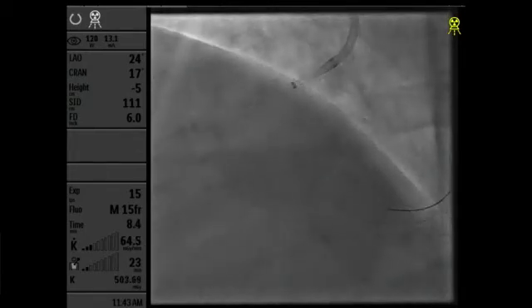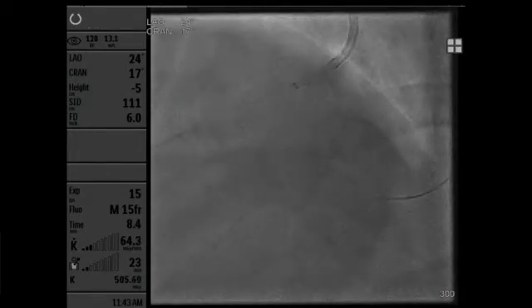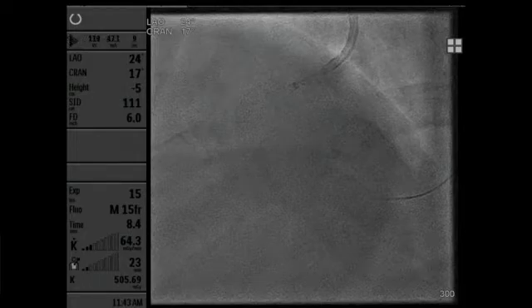I think you have to bring the guide telescope all the way down. Yeah, I have to unsheath it. Can I have a non-compliant 2.5 or 3.0, or a compliant one? Sorry, I meant compliant. Yeah, compliant would be easiest for you.